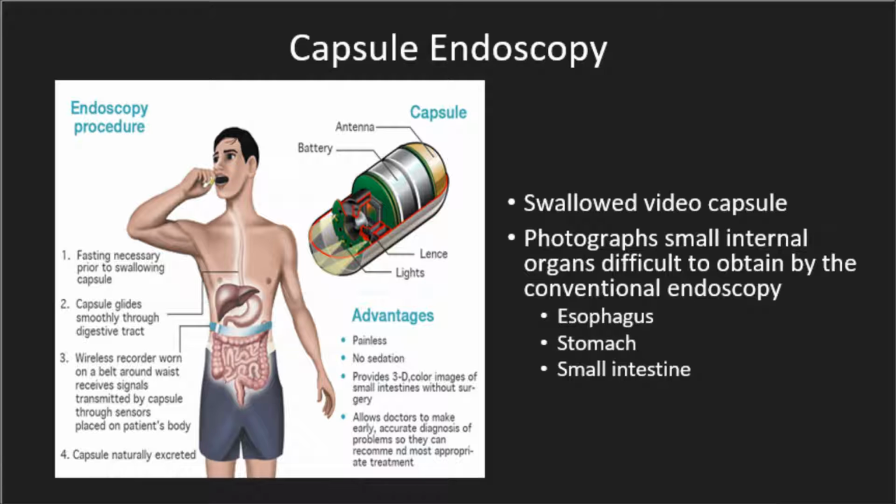The use of capsule endoscopy is aimed at recording images within the digestive tract for diagnostic measures in medicine. The capsule endoscope is highly effective at pinpointing bleeding in the secluded area of the small bowel. Capsule endoscopy is performed by swallowing a capsule, which then travels smoothly through the digestive tract into the stomach, through the small intestine, and then the large intestine.